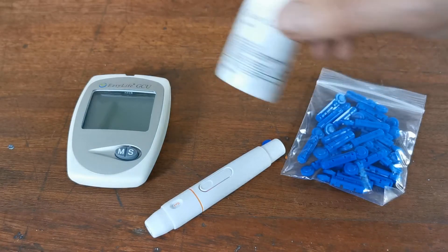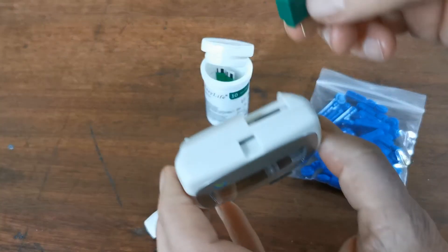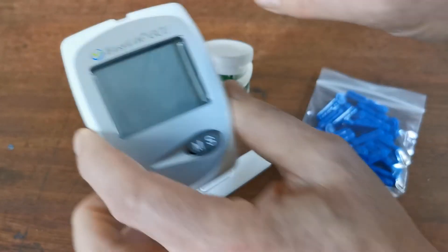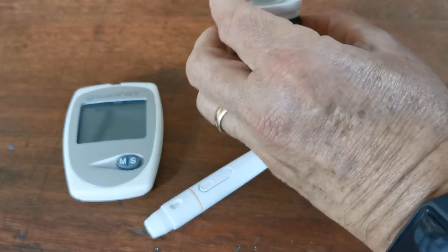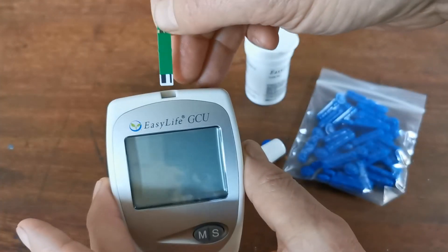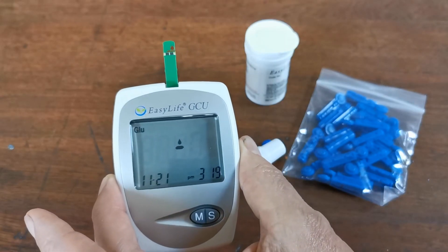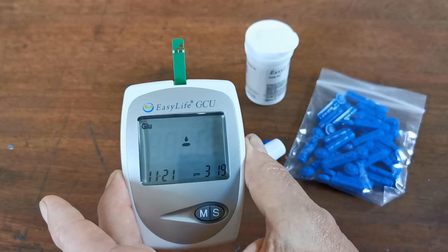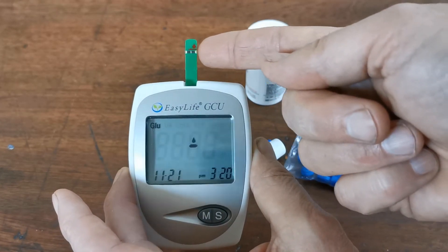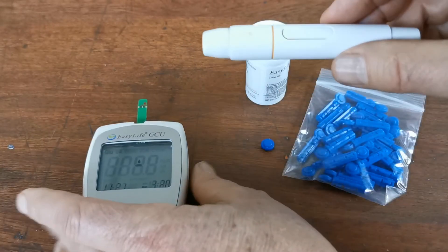Before lancing, you need to open your test strips and remove the code chip that comes with that batch of test strips. This goes into the port on the rear of the GCU meter. Once inserted, the meter will be turned on by the insertion of one of the test strips. Insert the test strip — this is the end that goes into the meter — and by inserting it you should see the meter start to come to life. You'll now see the flashing drop indicator asking you to apply a drop of blood. The opening that absorbs the blood is on the side of the test strip.